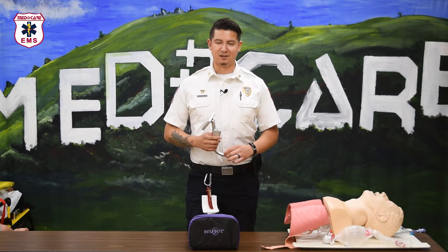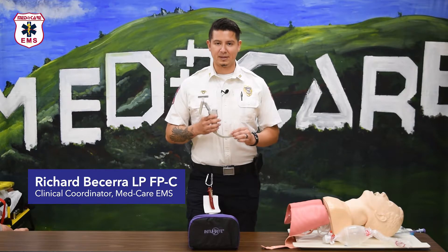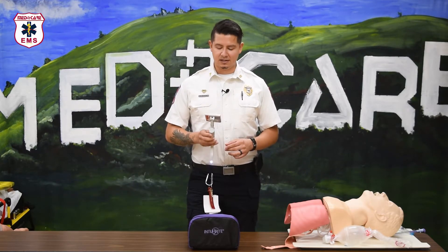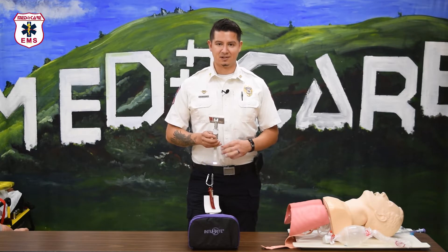Good afternoon y'all. My name is Richard, I'm the clinical coordinator. Today I'm excited because we're going to go over our new video laryngoscopes from Intabright. This video will go over the initial setup and technique, decon, and data transfer procedure. Let's get started.